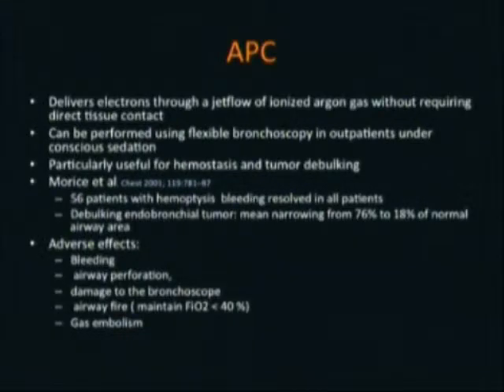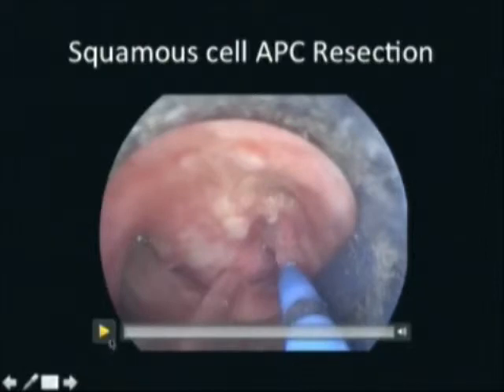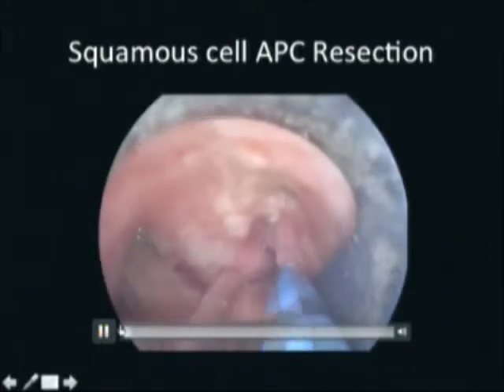Adverse events also similar to Nd:YAG laser: bleeding, airway perforation, much less airway perforation because you don't get a deep penetration, damage to the bronchoscope, airway fire if you don't keep your FiO2 less than 40%. And what's particular about APC, since it's insufflated gas, jet flow, you can have gas embolism if you are next to a vessel.